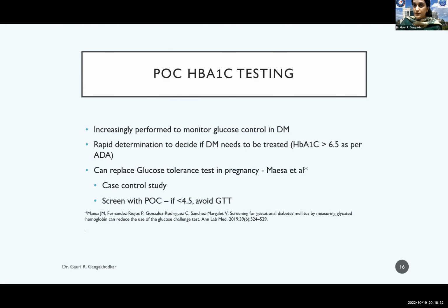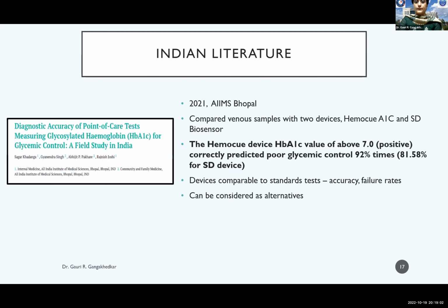How does this translate to our perioperative practices? So when we look at HbA1c testing, we look at a patient who's coming to the OPD with diabetes. And if it is going to be as simple as a pinprick, you're going to be able to figure out whether the patient's glycemic control was good or has not been good for the past 3 months, you can determine how early an elective procedure can be carried out, even in the face of currently deranged sugars. And that is promising indeed.